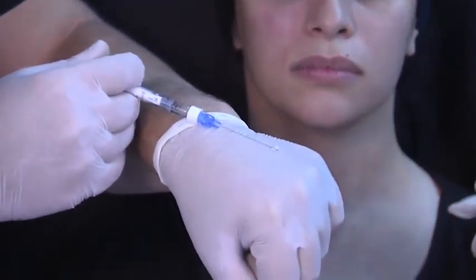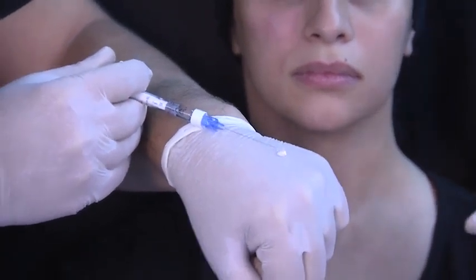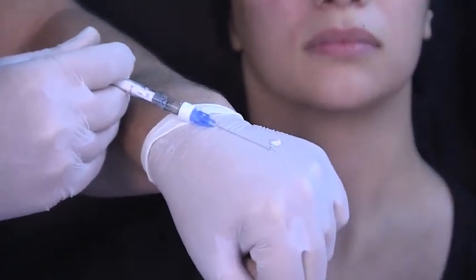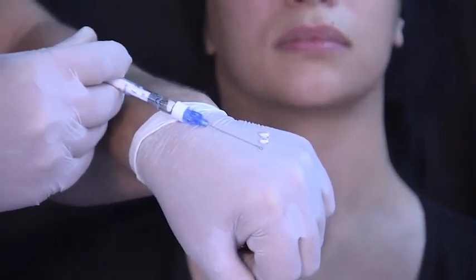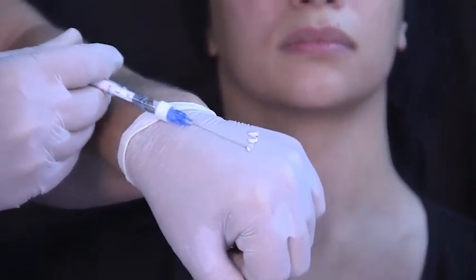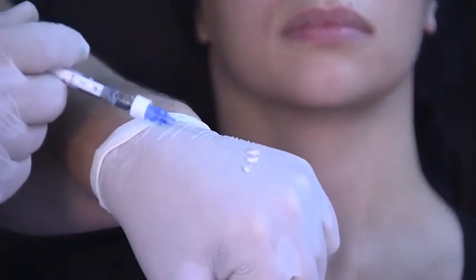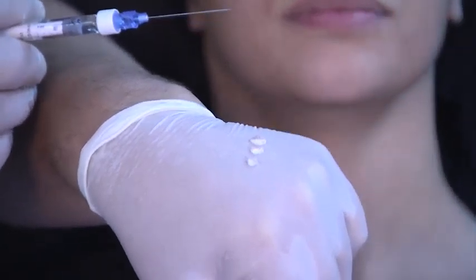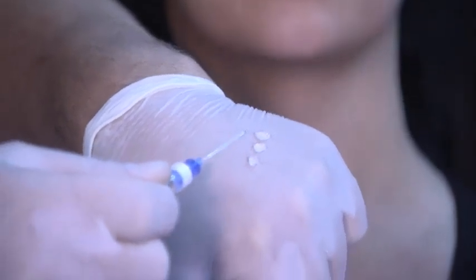Now, let me show you on my hand what I did. Can you go here, cameraman? Okay. So what I did was, look, 0.1. I stopped. I did 0.1. I stopped. I went, and again I did 0.1. And I like to stop and do these 3 boluses or aliquots, because then this product will distribute in the area better than if I create a barrier.